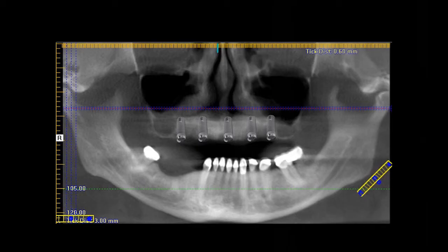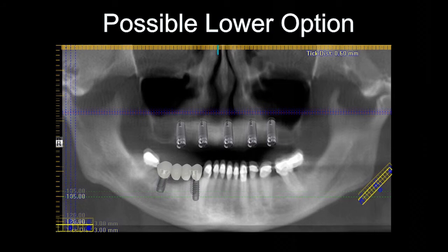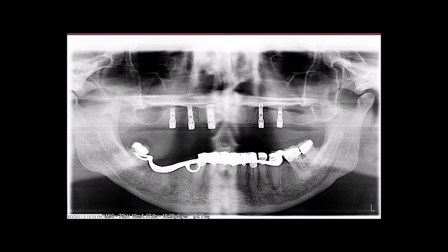This is the game plan. It's using Photoshop. Just kind of give him an idea what we're thinking about on the top, and then putting implants here on the bottom. Restoring it like so. So this is the case. 5 implants in the maxillary arch. He didn't want to do the bottom now. He's still in the partial. And these are tapered screw vent implants.